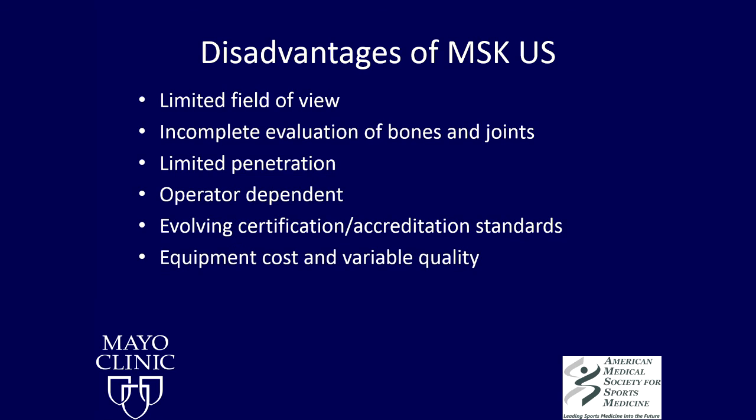And while equipment is relatively inexpensive compared to other imaging modalities, it's not without cost, and so you still have to spend the money in order to buy a good machine. And depending on how much you're willing to spend, you're going to have variability in the quality.